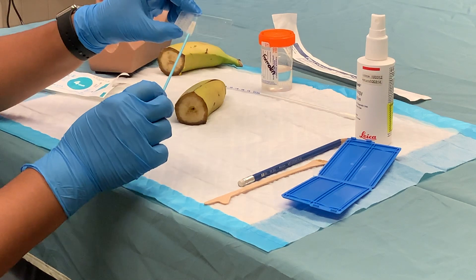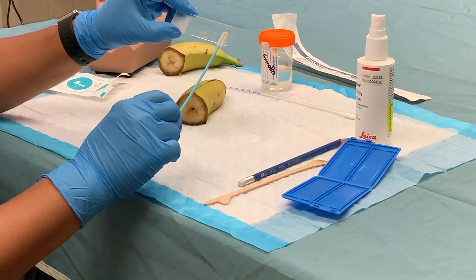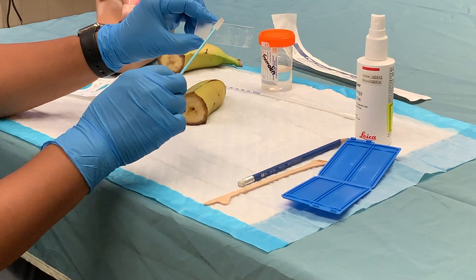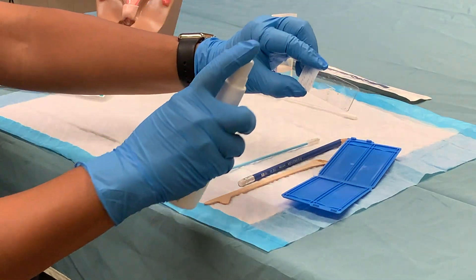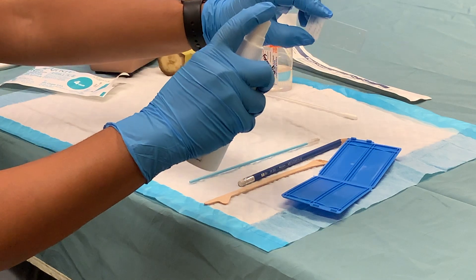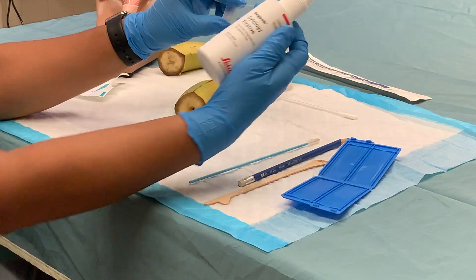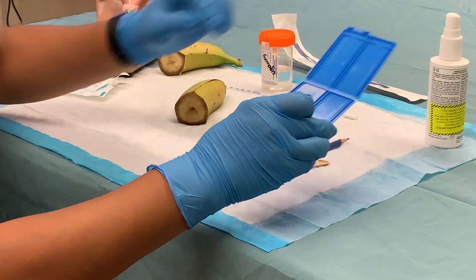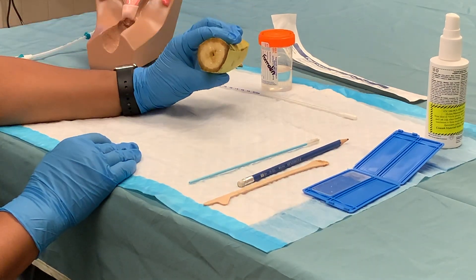Having done that, they spread the tissue that's been collected on a separate part of the slide in a rolling fashion so that both the exocervix and the endocervix has been sampled properly. Then the students will know to spray the slide eight inches away with Cytologic Fixative, and then place the slide on the jacket to allow it to dry. That is how we use the banana to teach them how to do a pap smear.